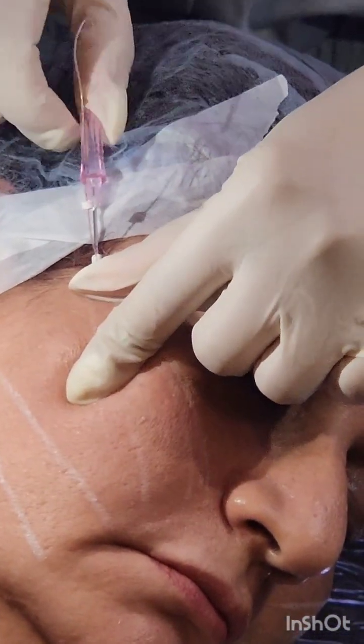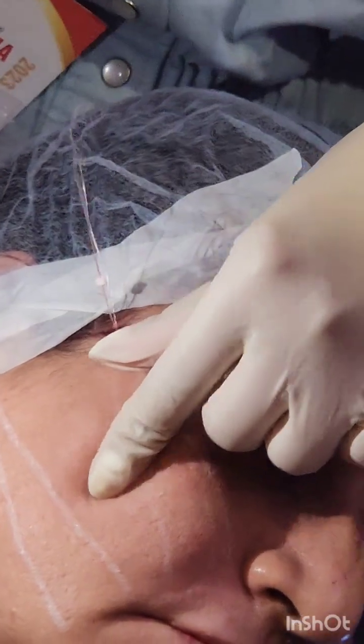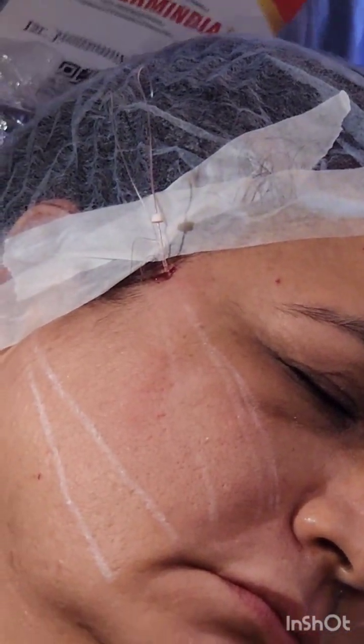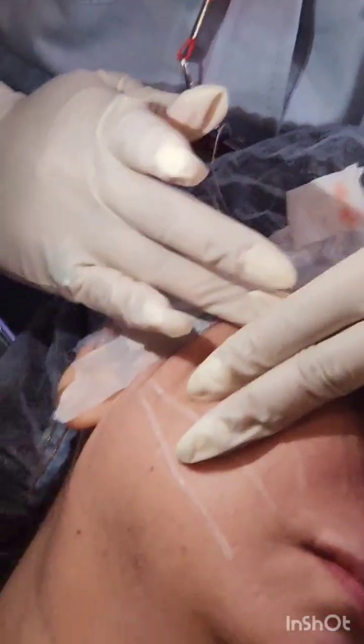She's damn good, she's not very comfortable. Yeah. So one twist and come out. Okay. Now comes the engaging of the thread. So lift the thread and engage the tissue. Massage the tissue up. Okay.